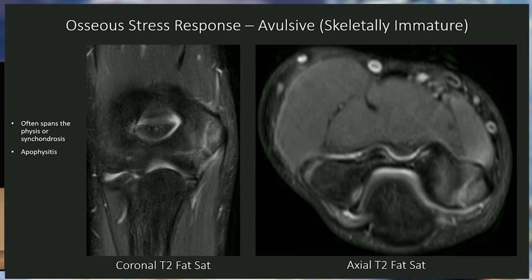Again, when we take a step back from the images and look at how that patient's skeletal maturation process should occur, the subchondral bone is essentially where bone meets cartilage. Beneath that, in the physis, we have the metaphysis and this interface, which is called the zone of provisional calcification, where the bone is elongating and growing and ossifying. So on X-ray, the subchondral bone plate can look irregular because it's forming. Especially if you look at a frontal or tunnel view of the knee, it can look irregular and it can look like an osteochondral lesion.